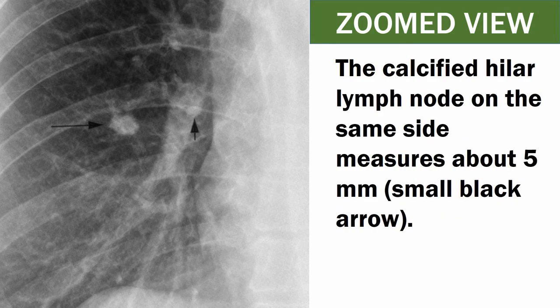The calcified hilar lymph node on the same side measures about 5 millimeters, which is shown with a small black arrow.